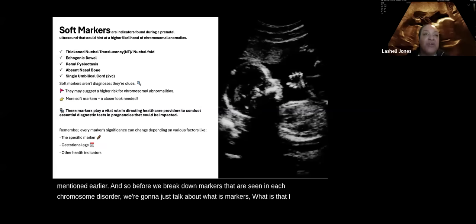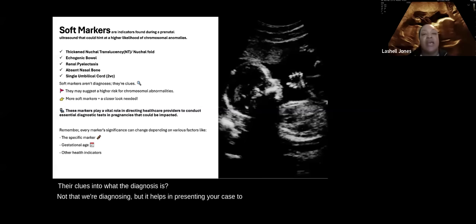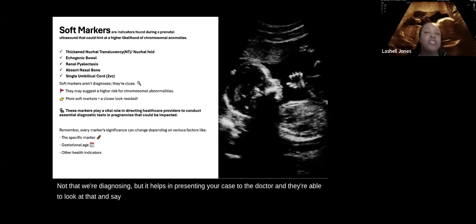Personally, I like markers because, as is mentioned here, they're clues into what the diagnosis is. Not that we're diagnosing, but it helps in presenting your case to the doctor, and they're able to look at that and say, oh, this looks like it could potentially be trisomy 21. But let's take a step further.